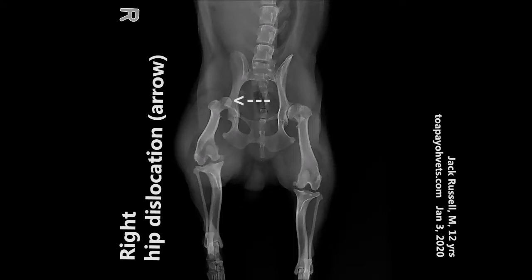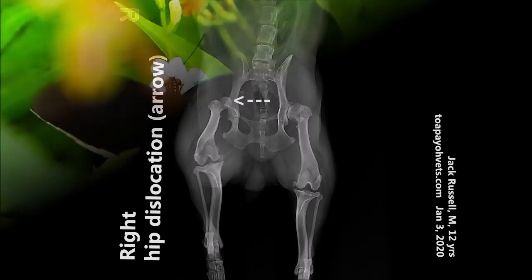Can you see where the arrow is pointed in this radiograph? Can you guess what's the problem with this patient? To know more, please tune in.